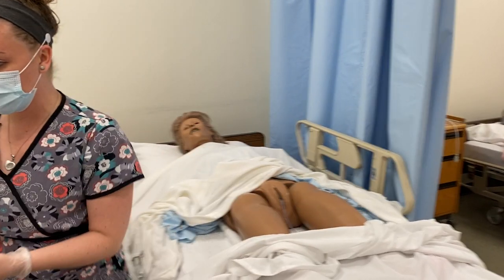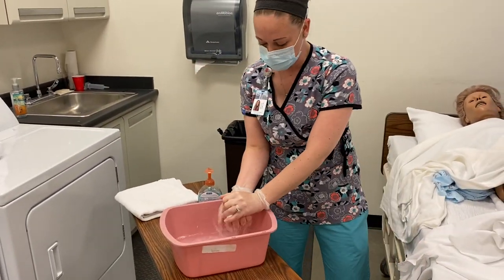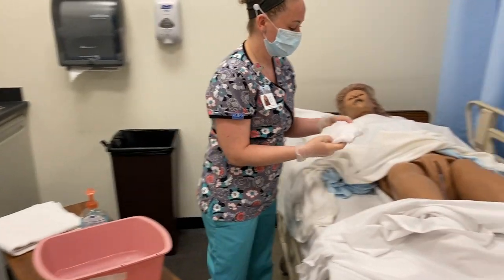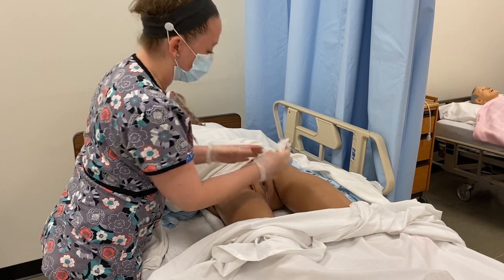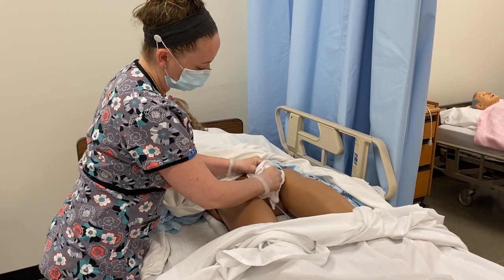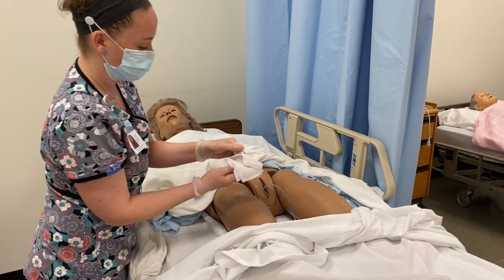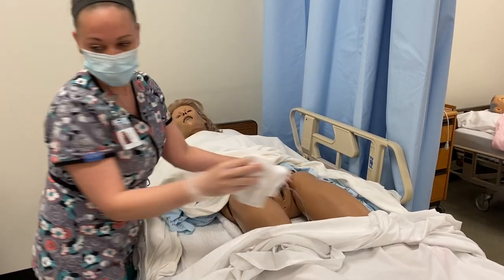I'm going to rinse in a circular motion at the insertion site. Get a clean portion, hold it, go all the way down one more time, then get rid of the washcloth.